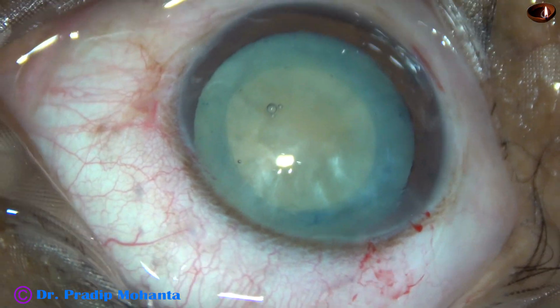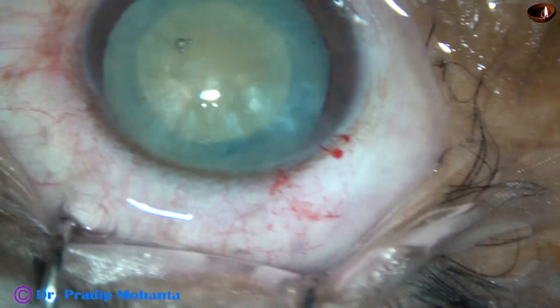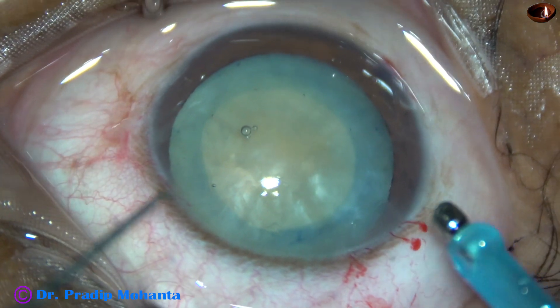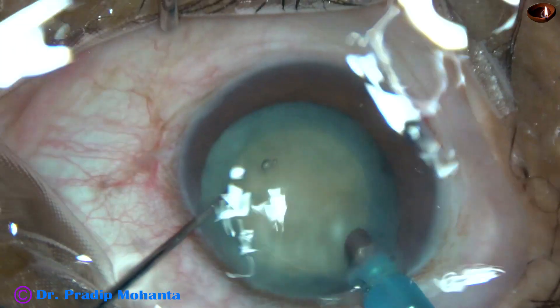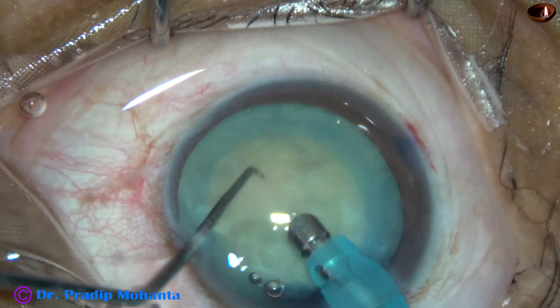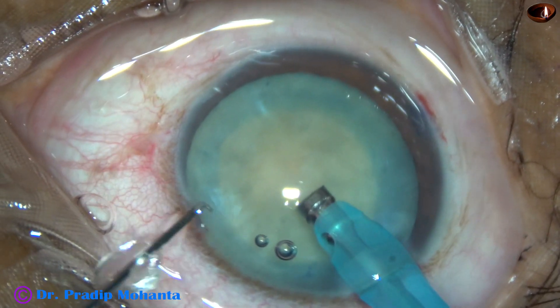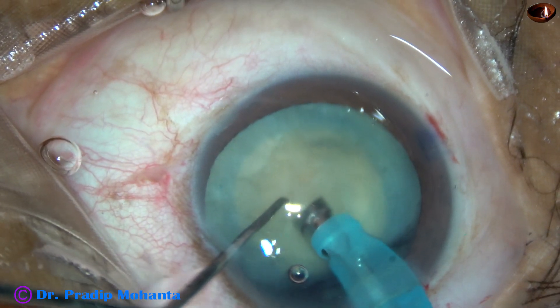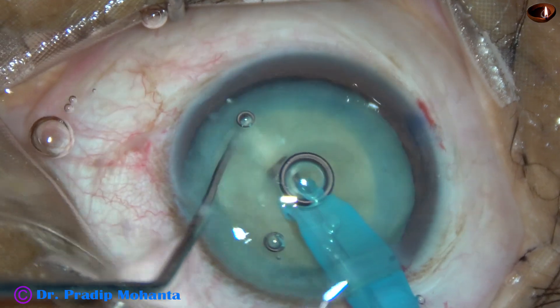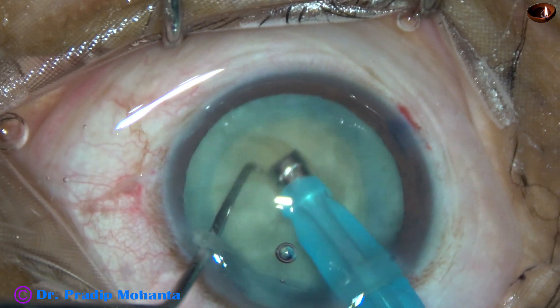Now is the time to introduce the tip of the phaco needle. The machine being used is Oertli Cataract 3 from Switzerland. The tip goes beveled down because it is easier to go inside with bevel down. Some more cortical matter is removed, then the handpiece is turned to make the bevel up. I am going to do a direct chop to divide this nucleus into fragments. The tip is buried completely into the substance of the nucleus, then I come back to vacuum, hold the nucleus very firmly, and divide the nucleus into pieces.